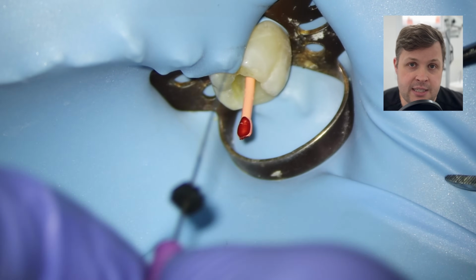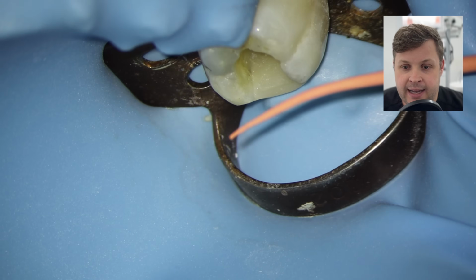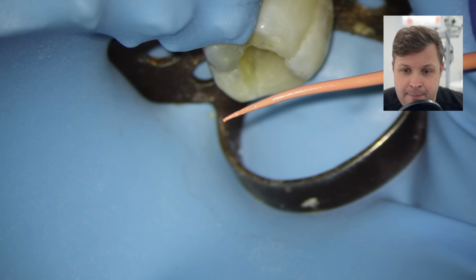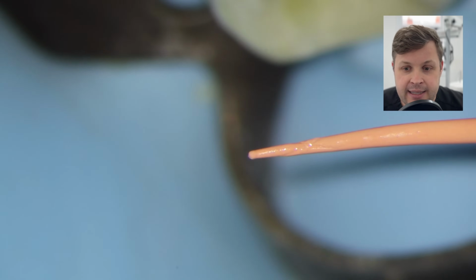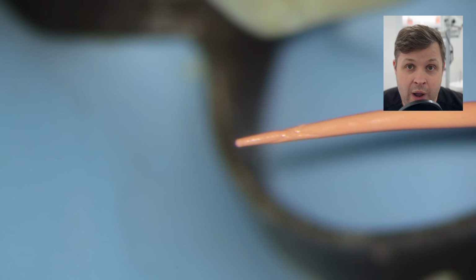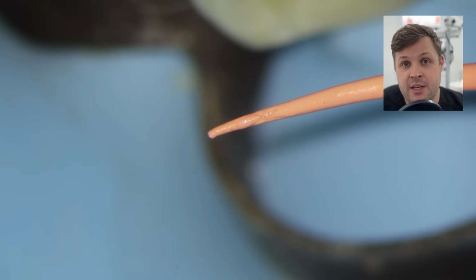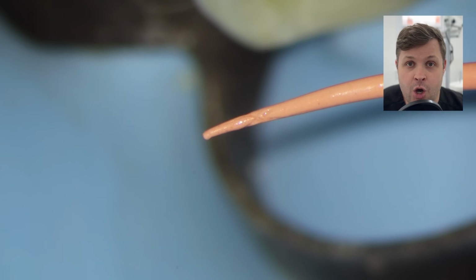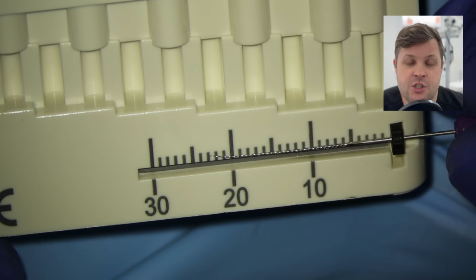I'm going to measure the stopper. I'm going to pull this size 10K file out, and then I'm going to inspect the end of the GP point. And as we can see here, there is a mark that the size 10K file has created on this GP point. And this shows essentially where the two canals join. And what we want to do now is measure the K file to see at what point this joins. And as we can see here, the join is at 23 millimeters.